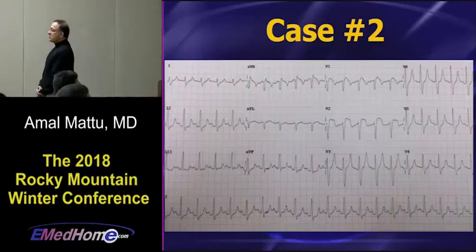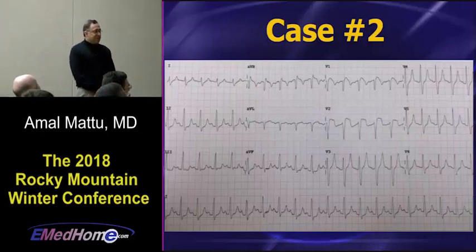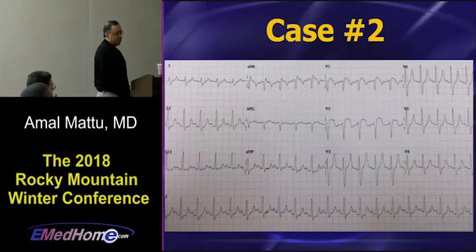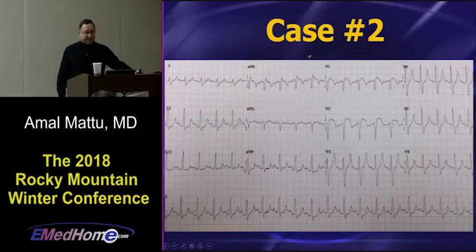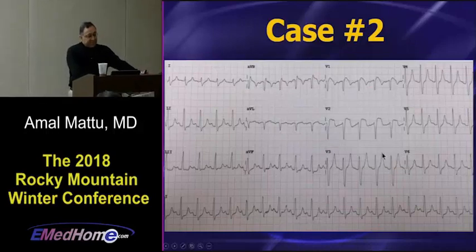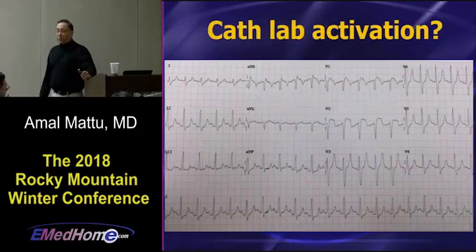Now, if this person shows up in your practice, what are you thinking? Thinking about activating the cath lab, big time ST elevation in those rightwardish leads. Once again, V1, V2, aVR. And while many of his colleagues were thinking activate the cath lab, he noticed that there also happened to be some mild peaking of the T waves and a rightward axis, which is not typical for a STEMI.